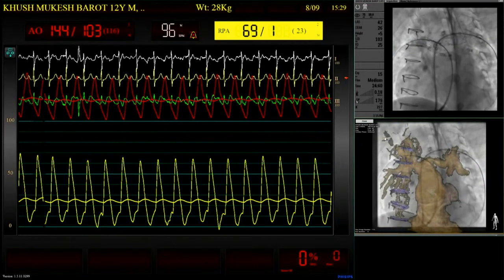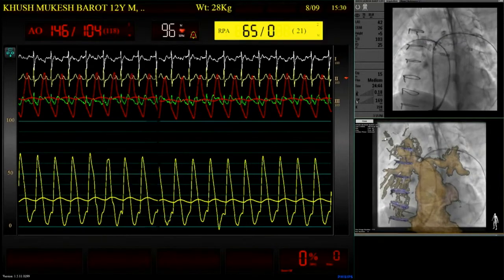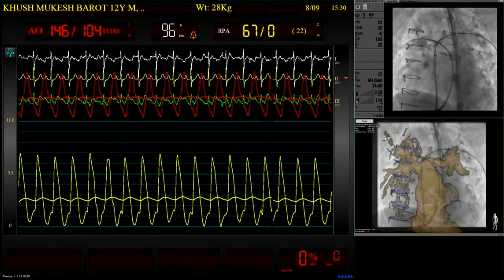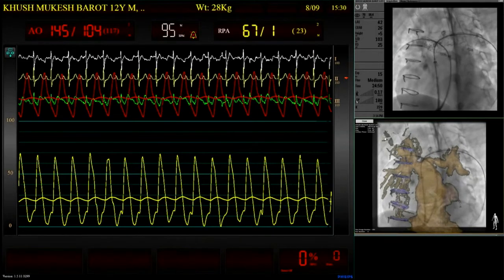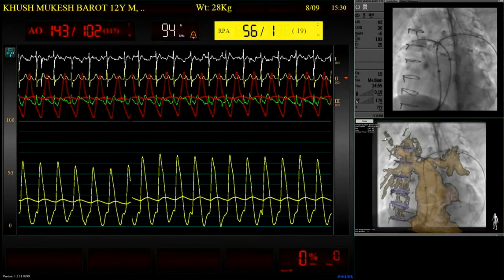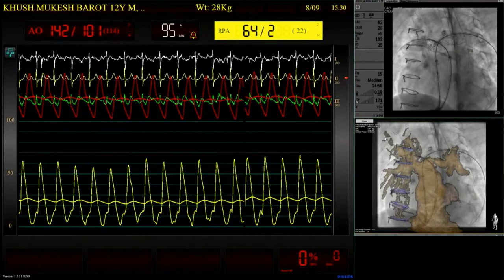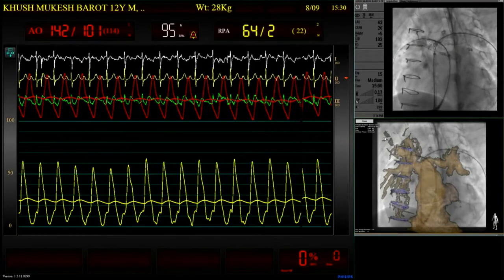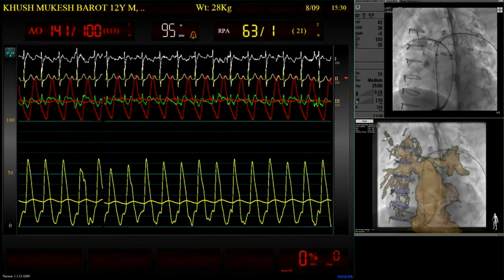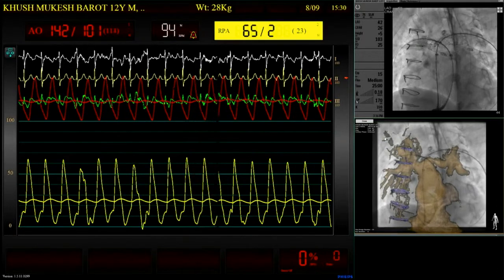Slowly withdrawing. Shiva? Yeah, Muthu. Shiva, we did a similar case 3 or 4 days ago, bilateral branch PS stenting. And the pressures didn't decrease like this after that. We only got about half systemic. And then post procedure, first day, the RV pressure was less. I think maybe an element of pulmonary edema will be there and the RV pressure will be holding up because of that. But angiographically the results look good. I think we should hold on.